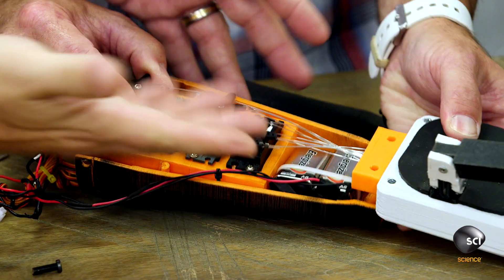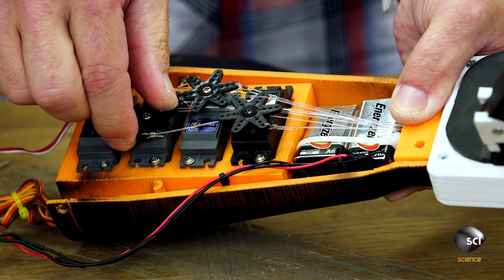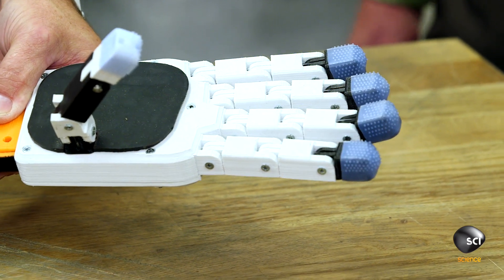I see you're using standard hobby servos here, and it looks like a pull-pull mechanism — is that correct? Right. So basically, when this motor turns, it's going to pull this string, and that string is going to cause the finger to rotate. Exactly. That's cool.